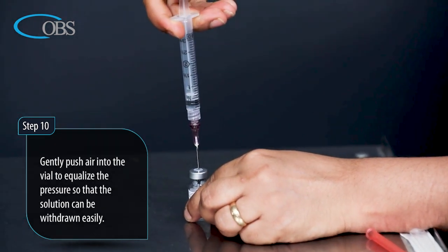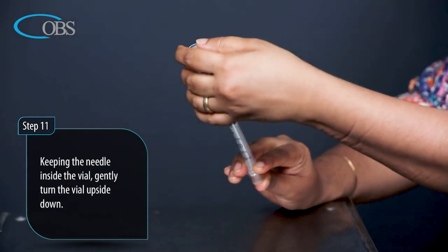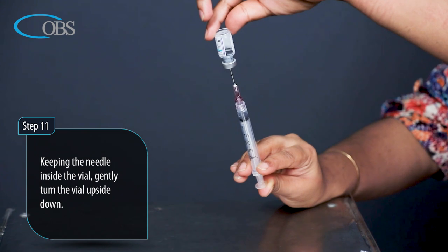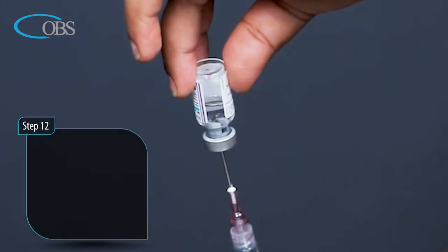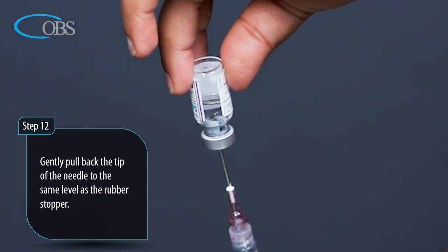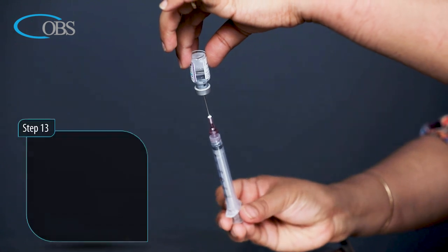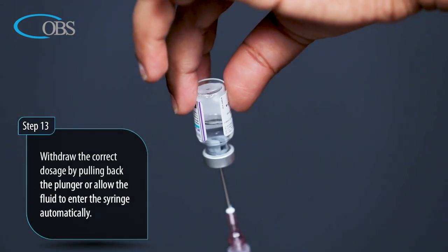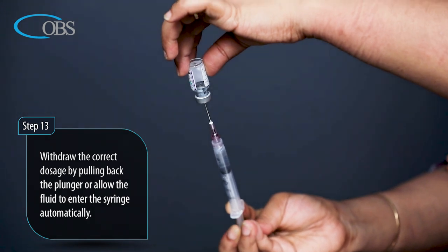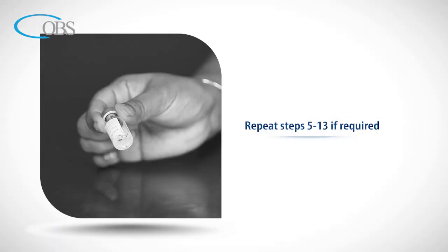Step 11: Keeping the needle inside the vial, gently turn the vial upside down. Step 12: Gently pull back the tip of the needle to the same level as the rubber stopper. Step 13: Withdraw the correct dosage by pulling back the plunger, or allow the fluid to enter the syringe automatically. Repeat steps 5 to 13 if required.